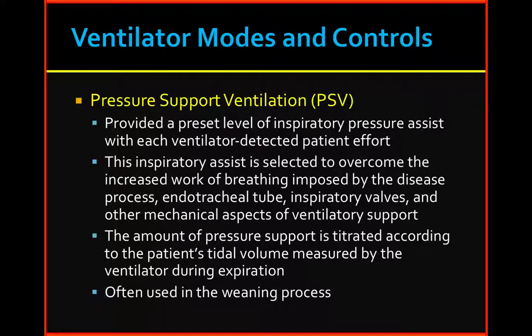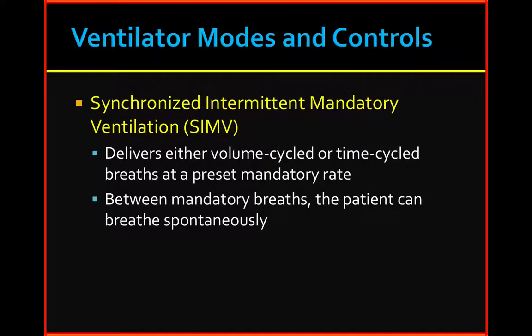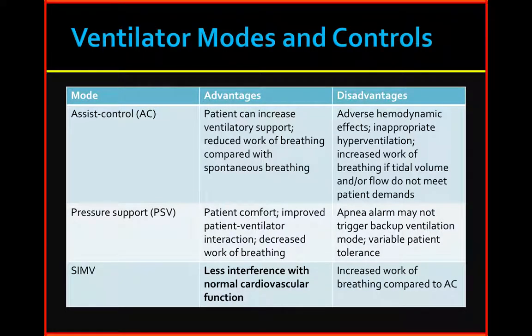And this can be used also as a weaning process. But SIMV is frequently done also. It delivers either the volume cycled or time cycled, and the patient can breathe spontaneously on their own. So this is the one slide that I think I want you to know. I've highlighted what's kind of important.